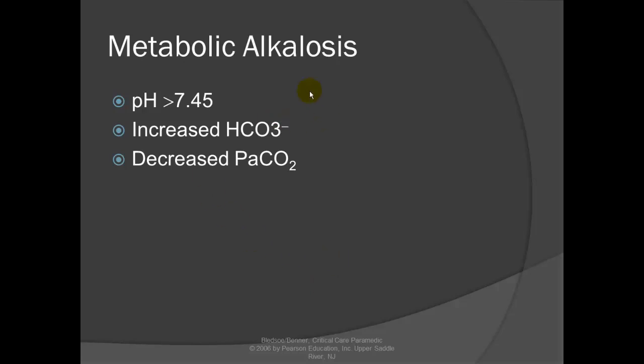So whenever they get to the emergency room, their pH is 7.55. Their PaCO2 is 20, and their HCO3 is, say, 35.